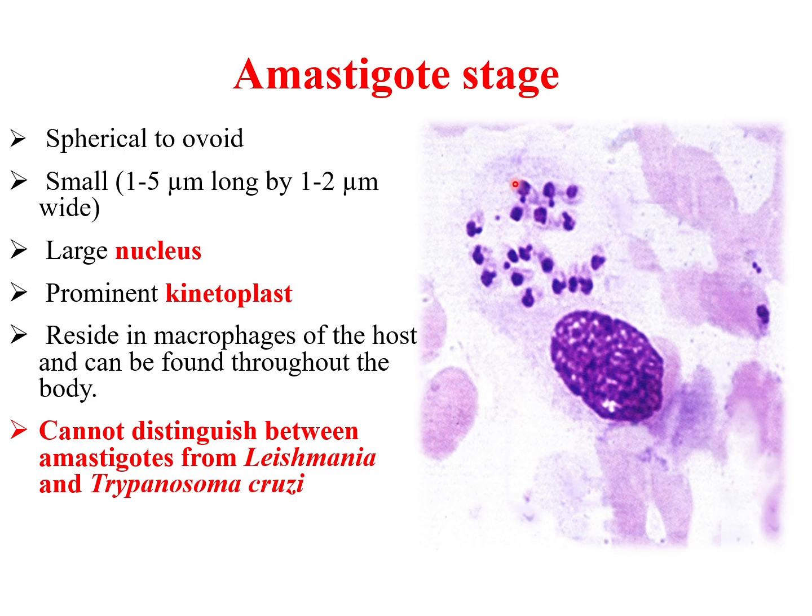So these amastigote stages are basically the clinical diagnostic specimen of the infection by different Leishmania species. It's worth noting that these stages are small. They lost their flagella, so they are not flagellated, and you can clearly see as well that they have a kinetoplast which occupies an anterior position if we compare it to the nucleus.